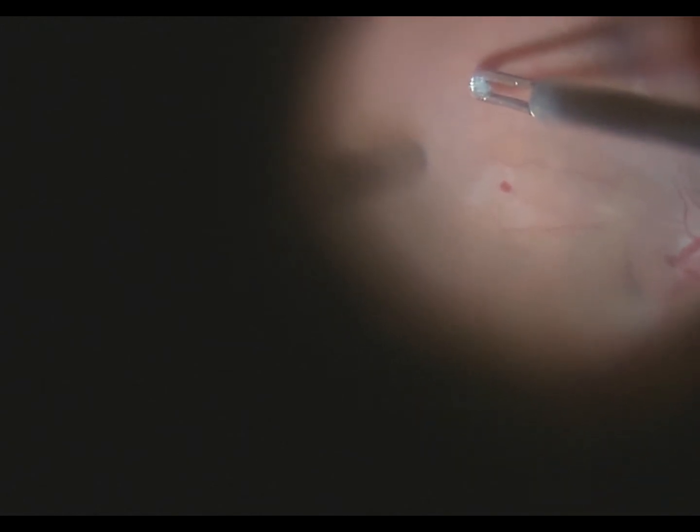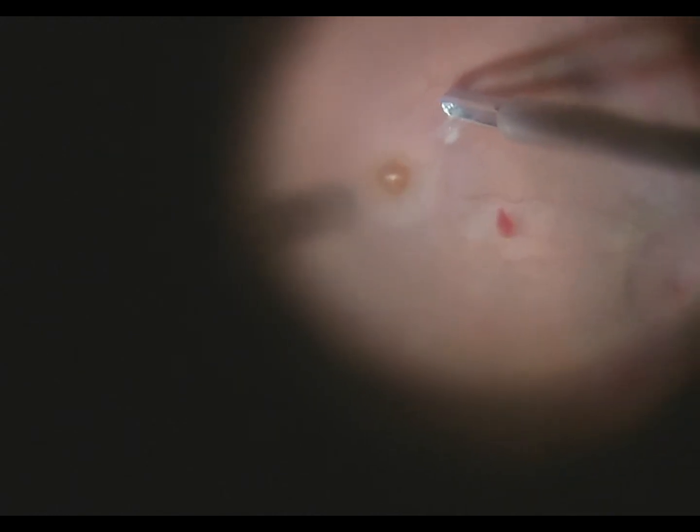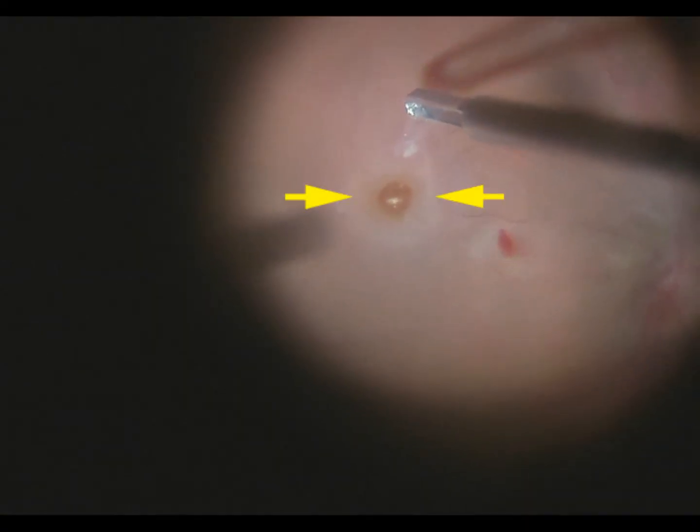The internal limiting membrane is a very delicate thin piece of tissue that lies on the surface of the retina. Here you see it being peeled free. The arrows are pointing to the internal limiting membrane, which you can just barely see as it's being removed from the surface of the retina. In areas where the internal limiting membrane is peeled, the retina does whiten a little bit, and sometimes there are little superficial retinal hemorrhages.